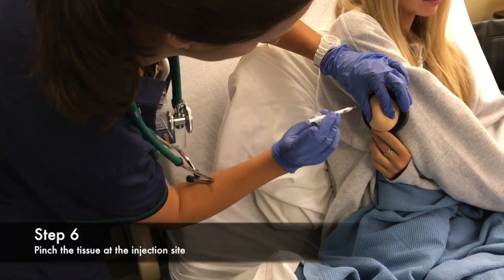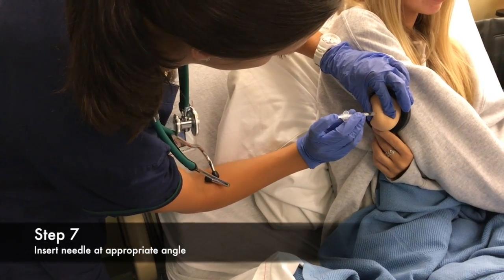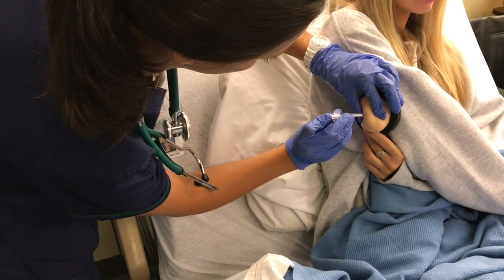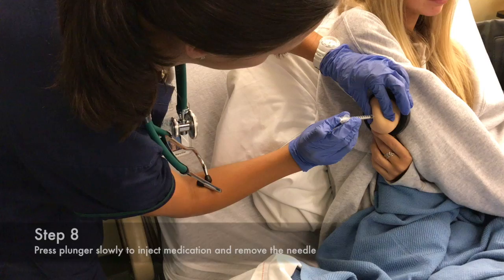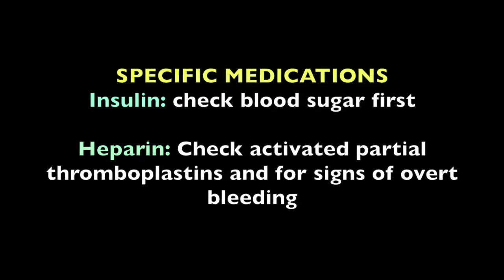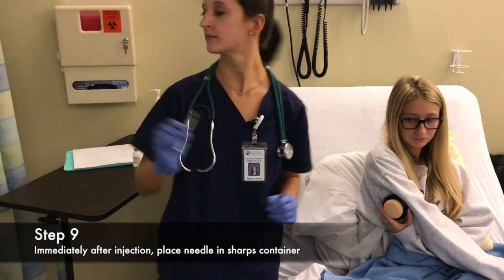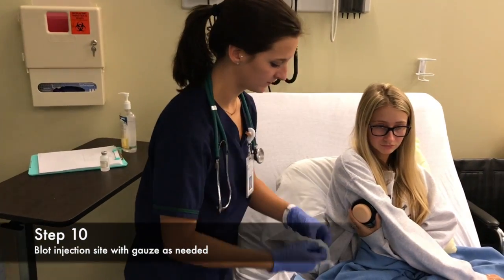Holding the syringe between thumb and index finger of your dominant hand, insert the needle at the appropriate angle. Using your thumb or index finger of your dominant hand, press the plunger slowly to inject the medication while stabilizing the syringe with your other hand. Remove the needle. Immediately after injection, dispose of the needle into the sharps box and blot the site with gauze if needed.